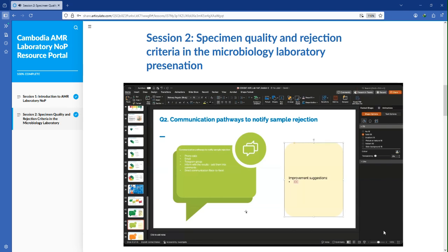Maybe I want to check your question, how to improve, do you mean improve the communication? Or how do you want to improve the communication of these rejections to the clinicians or to the ward? So, a good example would be a template, like an email template.